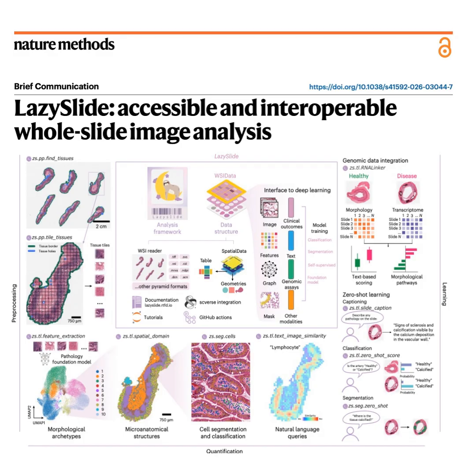First, LazySlide uses cellular segmentation algorithms like InstantSeg or CellPose to draw exact polygon boundaries around every single nucleus in every tile. So every cell gets a precise little boundary drawn around it. Right. Then, the STR tree maps all of those overlapping polygons onto a master coordinate system using bounding boxes. When the tree detects two bounding boxes overlapping across a tile border, it doesn't just jam the polygons together. Oh, so it's not just a blind copy-paste.